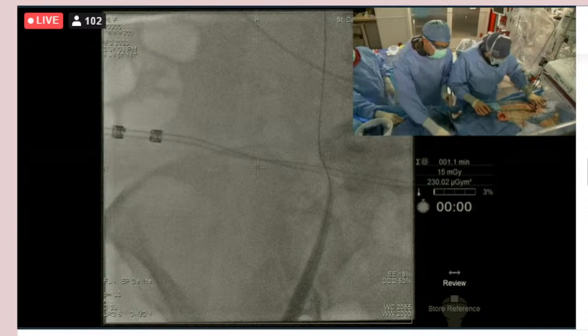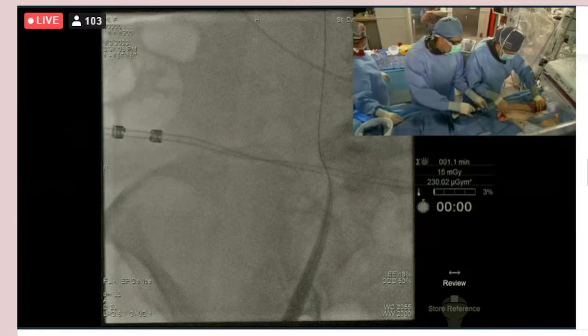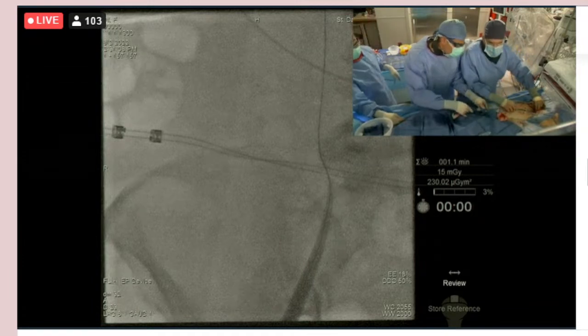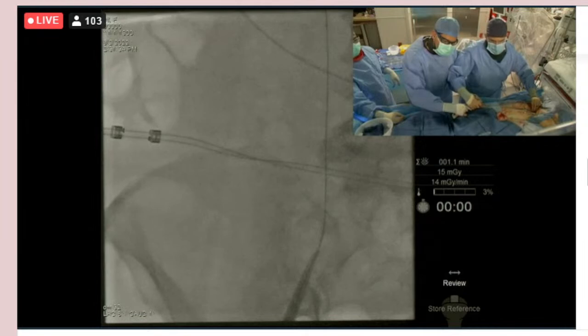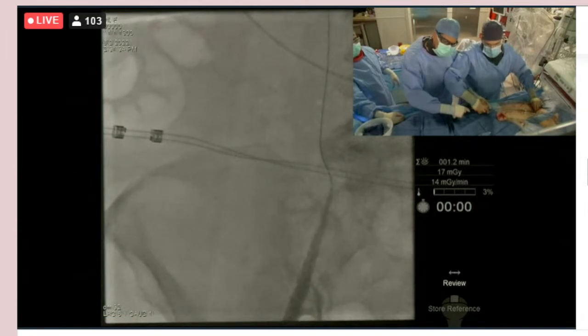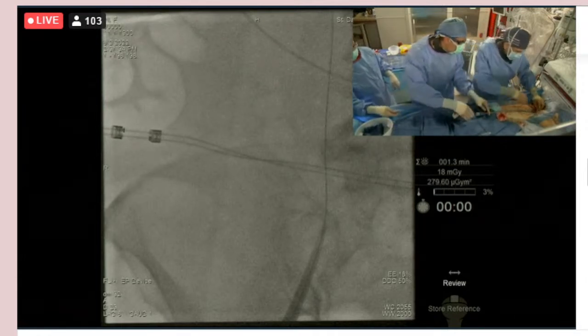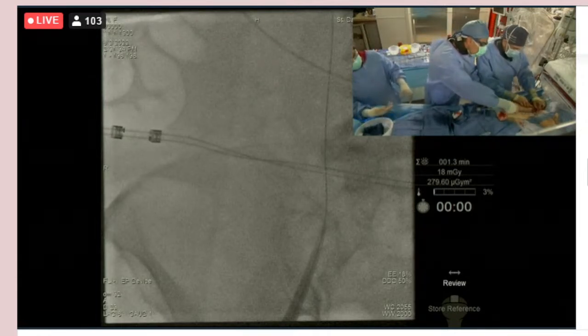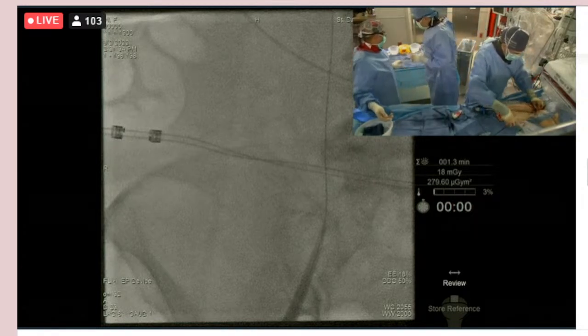I think it highlights the importance of watching it go up, because if you just kind of push this sheath, it's a monster, and you want to make sure that you're getting it up there. And sometimes you do have to switch out the wire to something stiffer, and other times you have to take out the dilator on this and just dilate with this separately, because what you really want to avoid is this thing going in a different direction than the wire. Right.